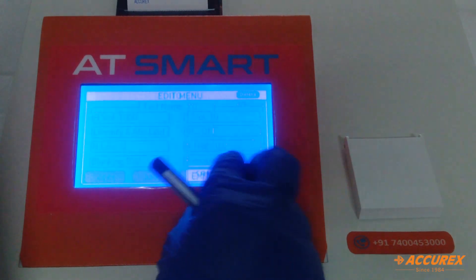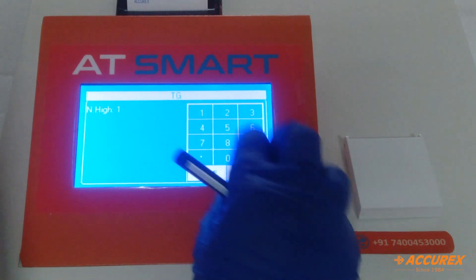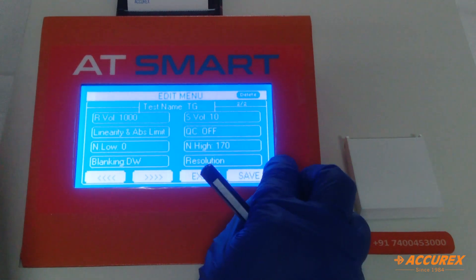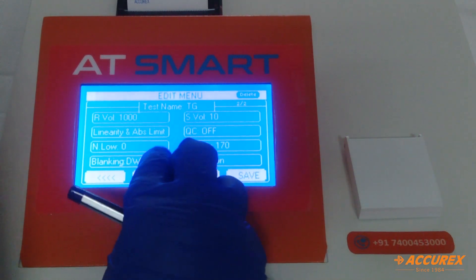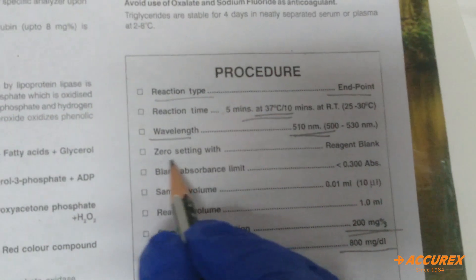Now set the normal range. Normal low is 0 and normal high is 170. Press 0 to 170 and save.